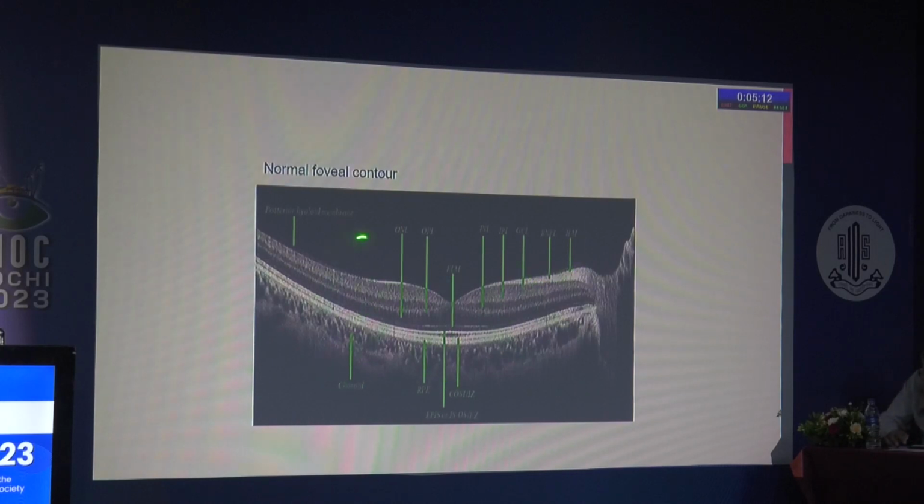Just one thing that I would like to highlight here: you are seeing a black and white picture. Actually, this is the ideal OCT that we should give to the patient, but normally we give pseudo colors. Pseudo colors sometimes miss out some of the lesions which are not that clear. And one thing we like to just have, these are the things that you will come across. But see, this is a line.